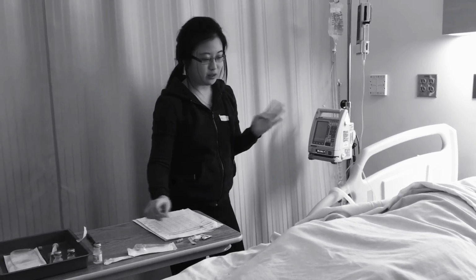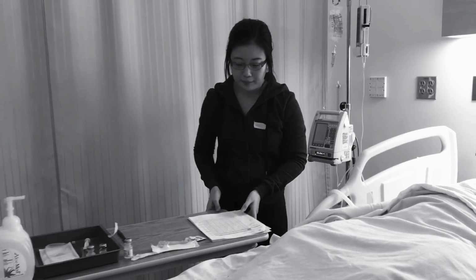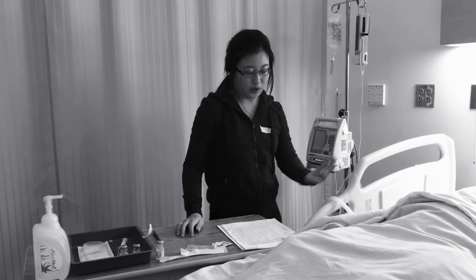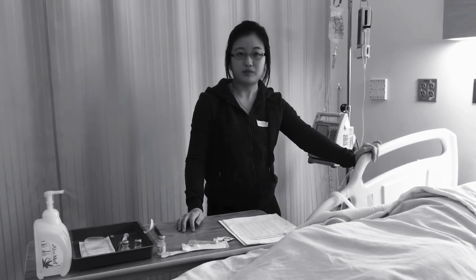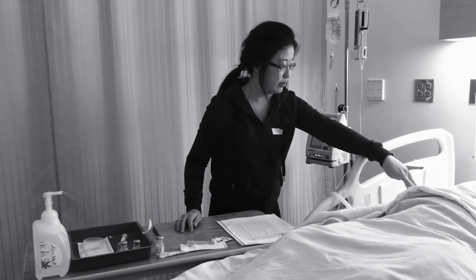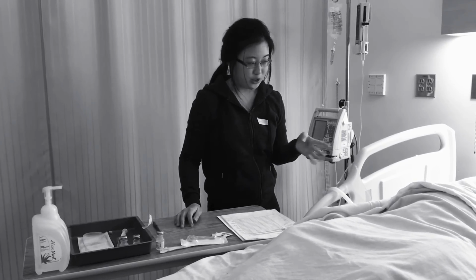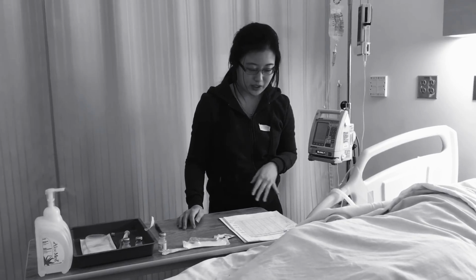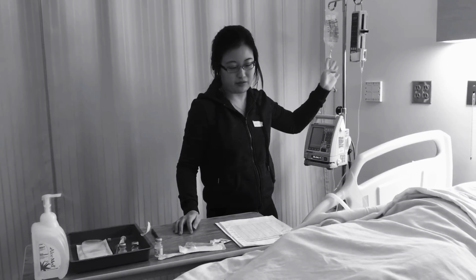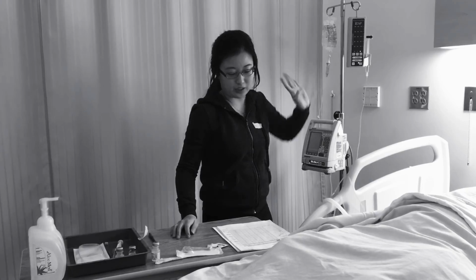So I told him what the medication is for, and he's taken it before, so he probably knows the side effects, but because he has diabetes, corticosteroids may increase his blood sugar, so he needs to watch out for increased thirst or urine, which he will let me know if he experiences anything, and he is getting this for his arthritis, which he probably knows because he's gotten it before. So I have to check back in a few minutes to see if the med is actually flowing and that the time is going down, which means it's actually going through.